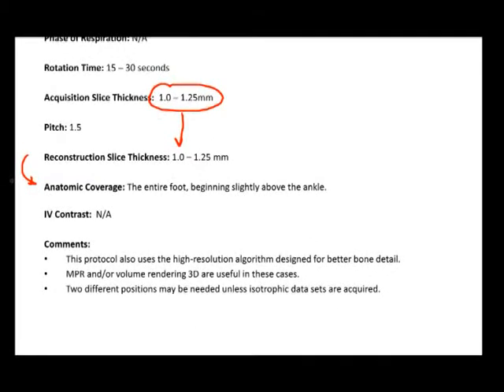We typically utilize the latter process, where the patient has their knees straight and their foot kind of flexed back. And the reason for this is because if you have their knees bent and their feet flat as you're scanning through, then what happens is that the ankle joint is not entirely visualized correctly. And so there is some angulation effect there. But if you have the patient laying supine with their knees straight and their foot kind of flexed back in just a normal position, then you can instantly see both the ankle and the foot in a higher degree. So we typically favor that.